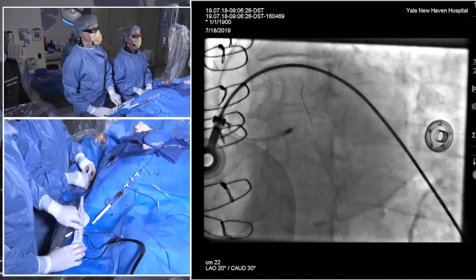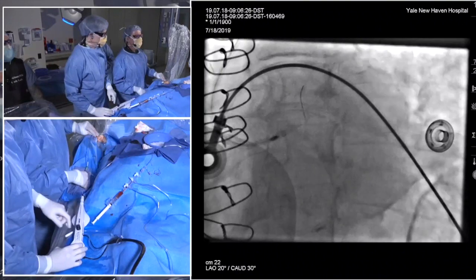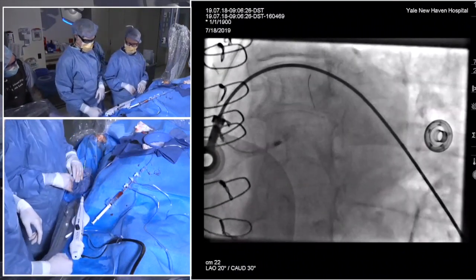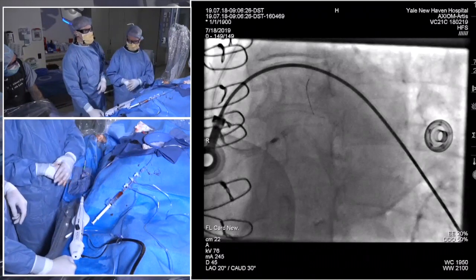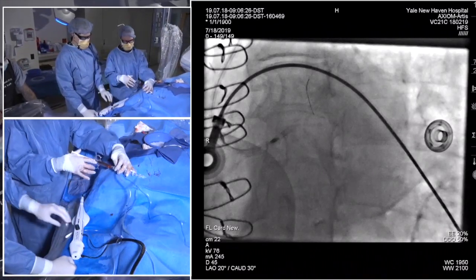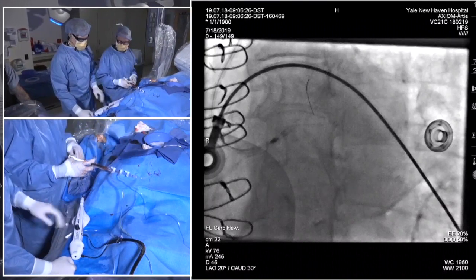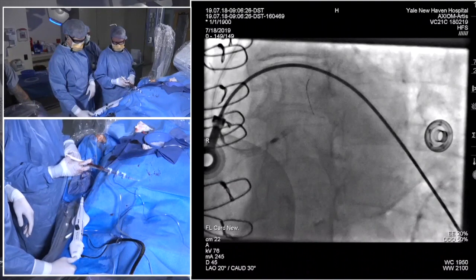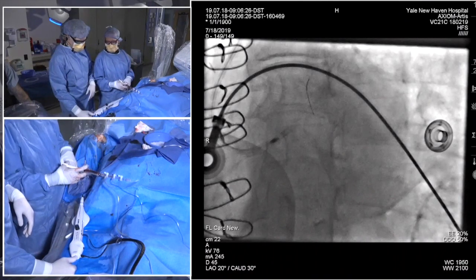The reason I make that point is because there is this misnomer, I think, out there, especially in the U.S., that if you're doing a left main, you need to use hemodynamic support. In fact, 25% of cases in NCDR are done that way, and hopefully we'll show in this demonstration that that's not necessary for cases like this, which are done thoughtfully with adequate preparation of the right side as well, for all the reasons Jason mentioned.